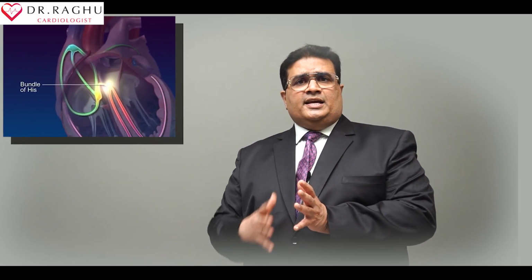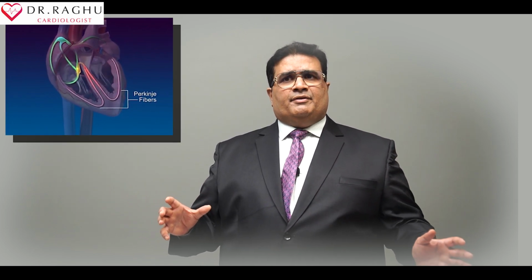We can adjust the electrical circuit direction and the delay between the chambers. So, we will be able to achieve an efficient contraction of the heart because we get the left ventricle to activate earlier compared to the right ventricle, which is the normal way a natural heart beats.